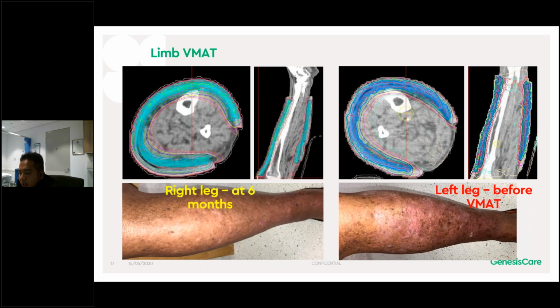I would see the difference between the changes on the skin prior to radiation and at 6 months on the leg. It looks so different, and the patient's very happy not having to have any more intervention done. You just need to follow up over the years, hopefully.